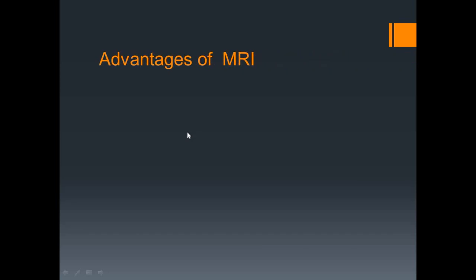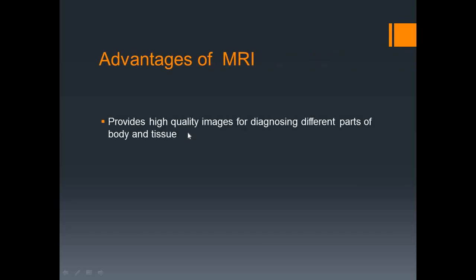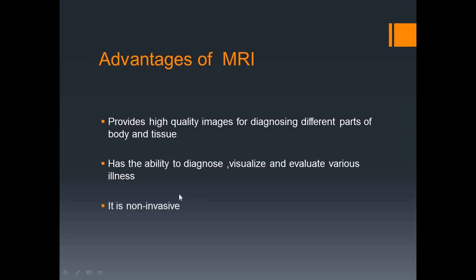Advantages of MRI. MRI has lots of advantages. Especially, it provides high quality images for diagnosing different parts of the body and tissue, and has the ability to diagnose, visualize, and evaluate various illnesses. It is non-invasive and doesn't use ionizing radiation.